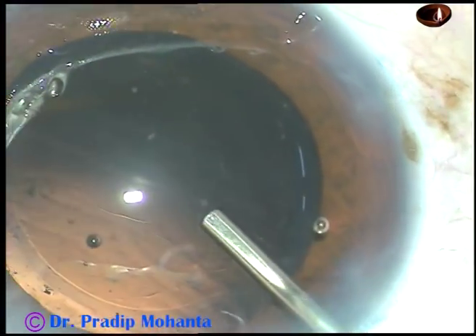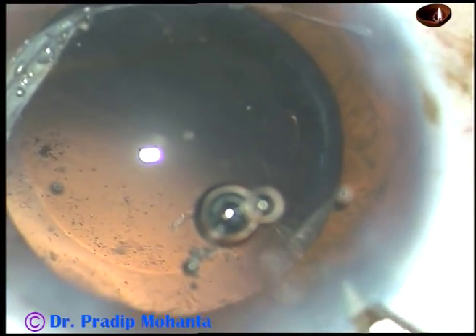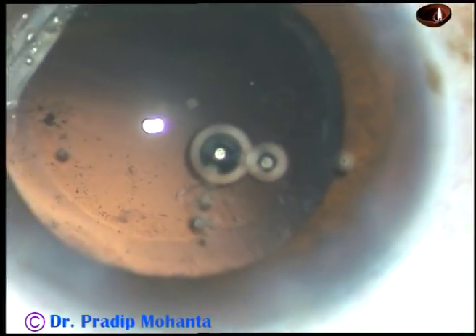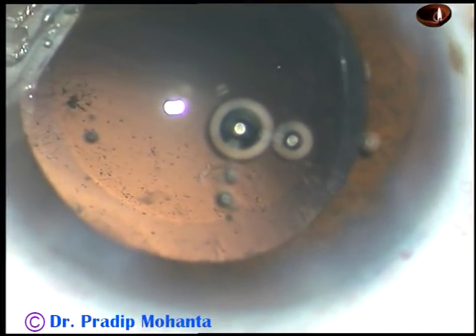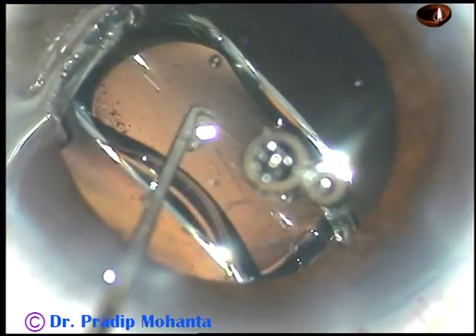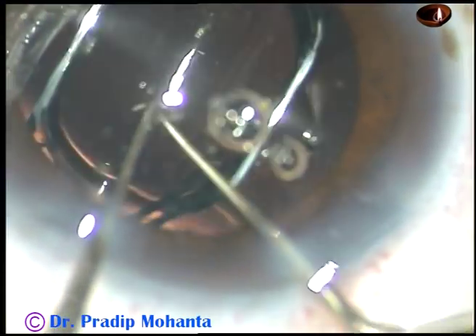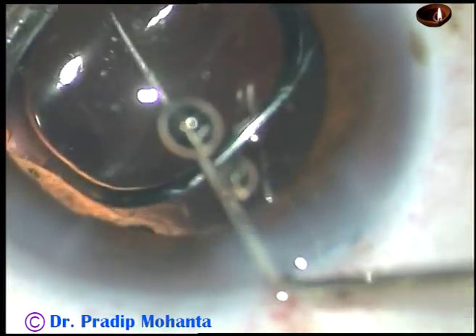Now the bag is being filled up with viscoelastic substance — the capsular bag and anterior chamber. The main incision is enlarged a little bit because I am using a B cartridge. This is a hydrophobic acrylic intraocular lens from Bausch and Lomb. The lens is in the capsular bag.